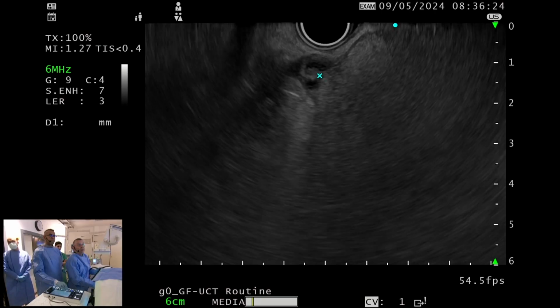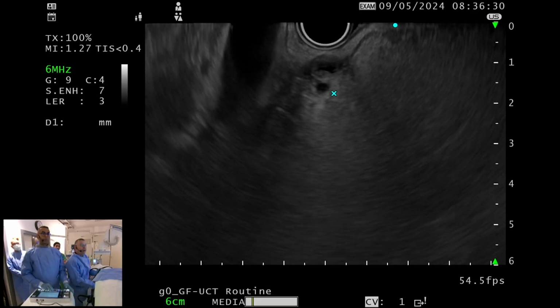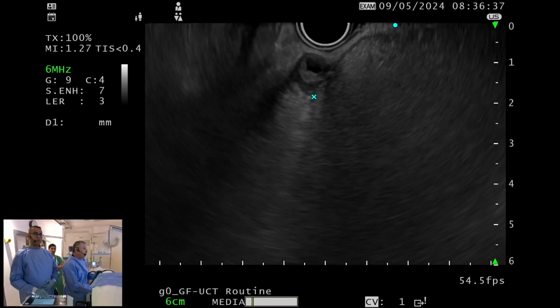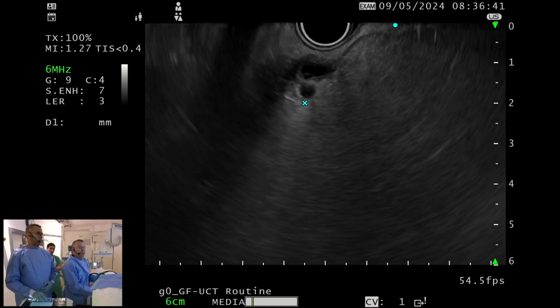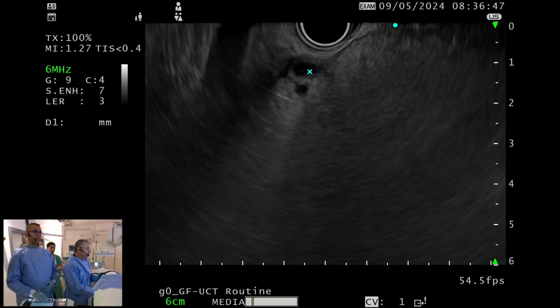So you can say that this patient has a functional obstruction, but not an organic obstruction. Functional obstruction means that he has been cholecystectomized already. We know that in 70% of patients with cholecystectomy, the diameter of the common bile duct increases with years.